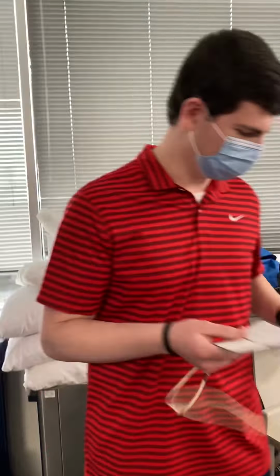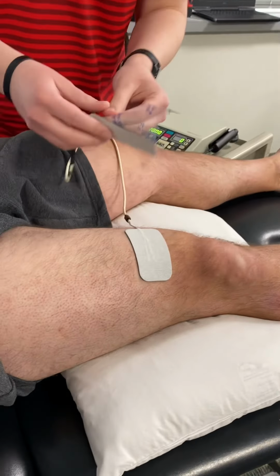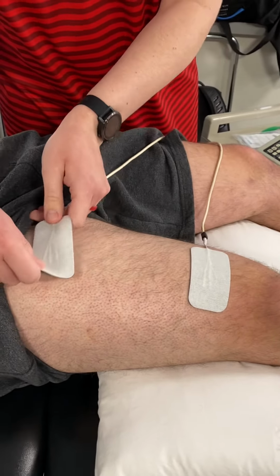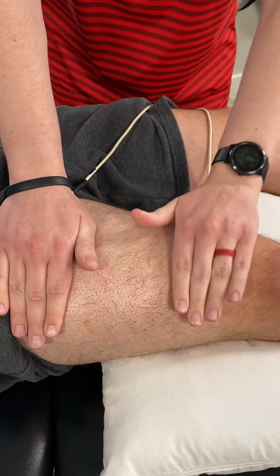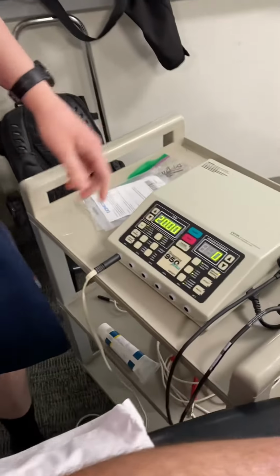Okay, so I'm going to hook my patient up here. I also assess that he doesn't have any broken skin in this area. Make sure that those are on there. Okay, so I'm going to come over to my E-stim unit.